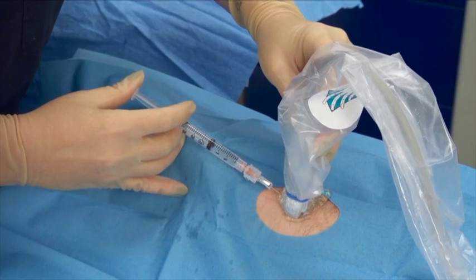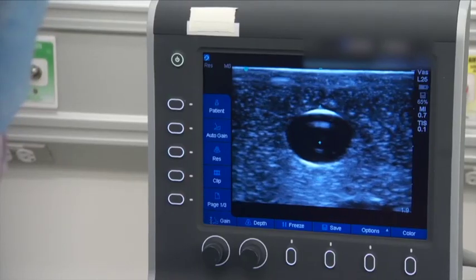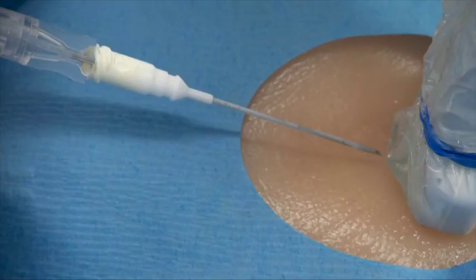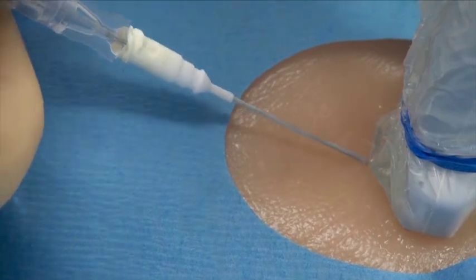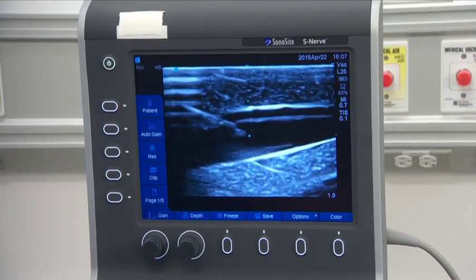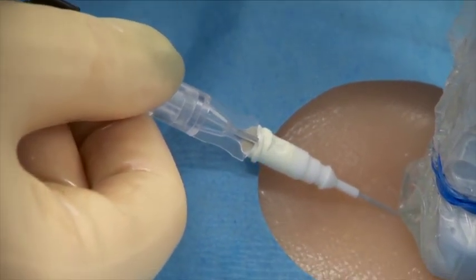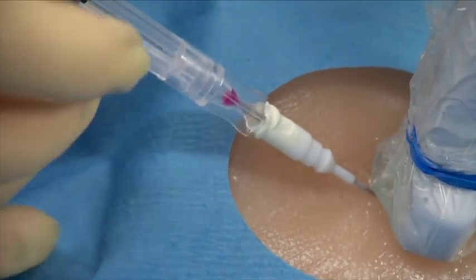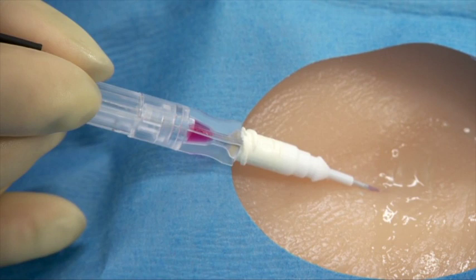Administer local anesthetic when indicated. Use the ultrasound when available to visualize infiltration of local anesthetic at the intended insertion location. Using the ultrasound, identify the artery. Puncture the vessel using a continuous, controlled, slow forward motion. The unique design of the Quick Flash catheter with flashback windows allows for quick visualization and confirmation of a successful arterial puncture. Once blood flow is visualized in the flashback windows, stop the advancement of the needle. Blood flashback indicates a successful entry into the artery.